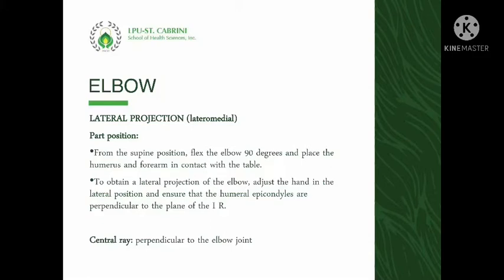To fully obtain the lateral projection of the elbow, adjust the hand in lateral position and ensure that the humeral epicondyles are perpendicular to the IR plane. The central ray is directed perpendicular to the elbow joint.